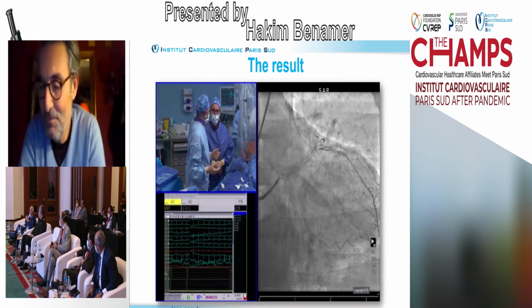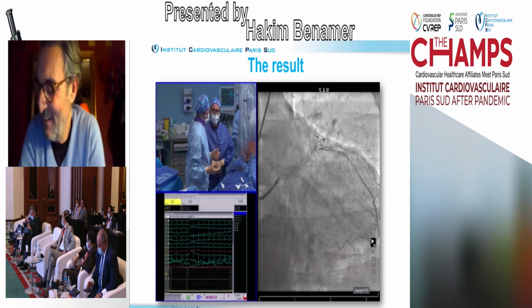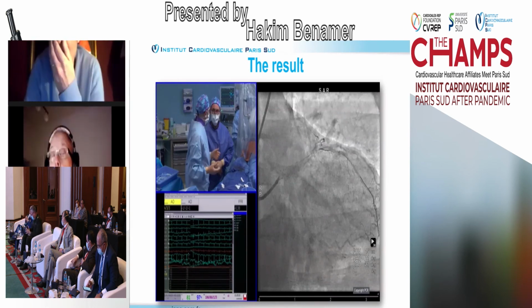Hakim, thank you very much for this illustration about tips and tricks, POT, re-POT, wiring, rewiring. But I also have something which you learn from experience, like you and others in different lives: if you are ending with the bifurcation, this is very important, go with the guiding out and then remove wire by wire and balloon by balloon.